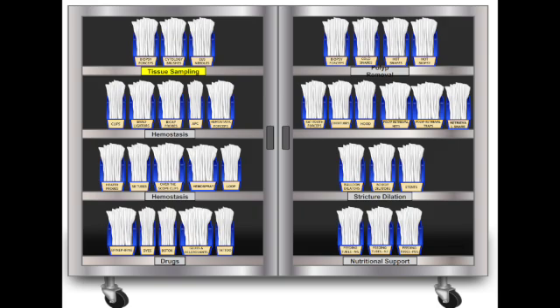And this knowledge, this foundation, it absolutely has to be paired with an awareness of safety and risk. That's a critical point. Dr. Rogers' material really emphasizes this. If these instruments aren't fully understood, if they're not used correctly, especially things like the energy devices, the dilators, the snares, they carry real potential for serious harm. Like what? Trauma, uncontrolled bleeding, perforation. Understanding the potential pitfalls is just non-negotiable.